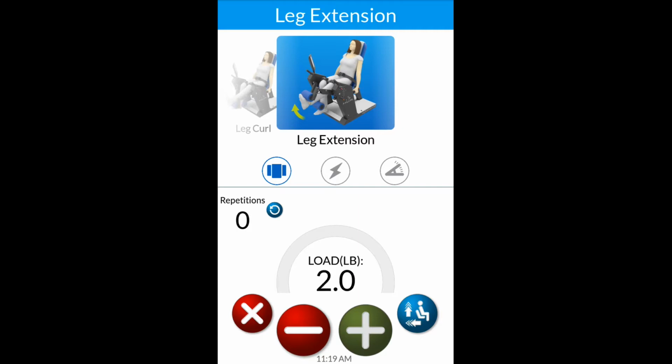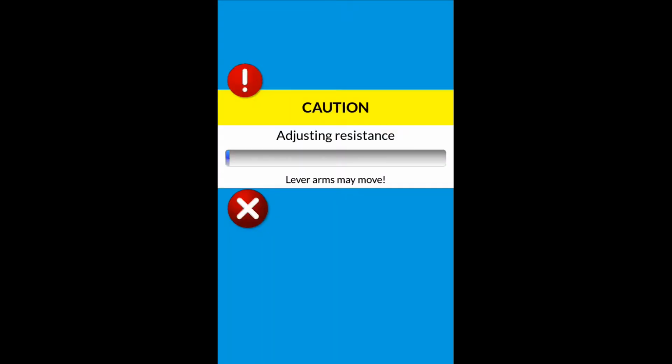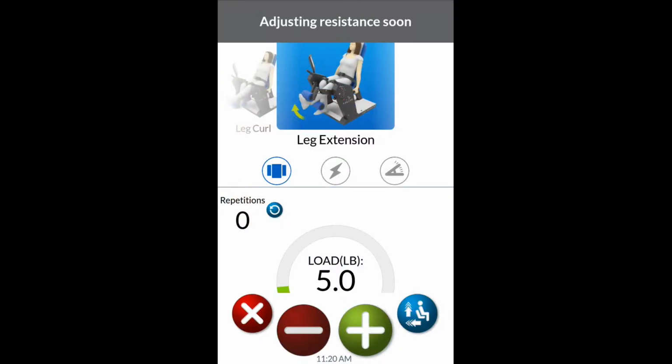Again, increasing the resistance is as easy as tapping the green plus button. When you do this, the resistance changes by increasing the air pressure in the machine's cylinders. This may cause the lever arms to move. Decreasing the resistance is done by selecting the red minus button. You will hear air releasing, and again the lever arms may move.